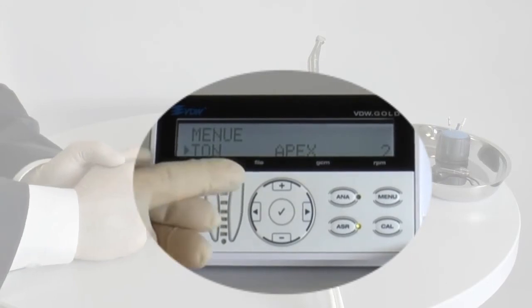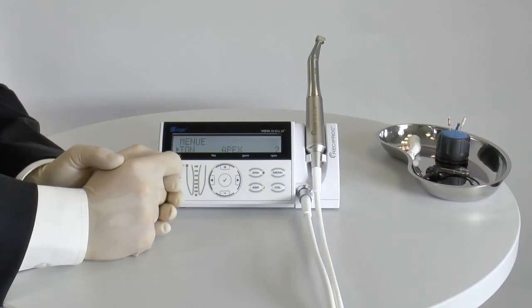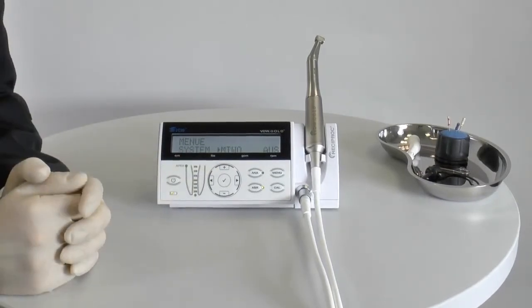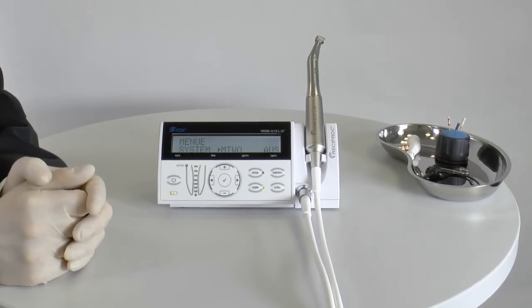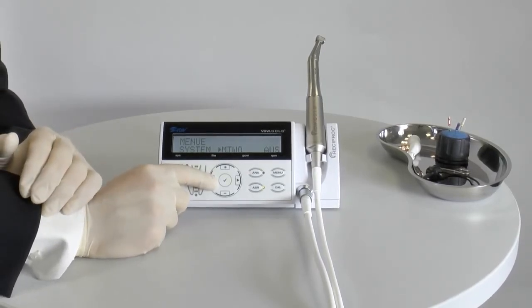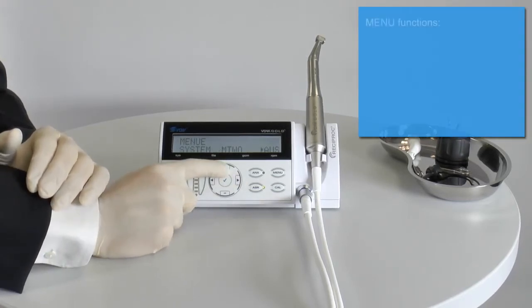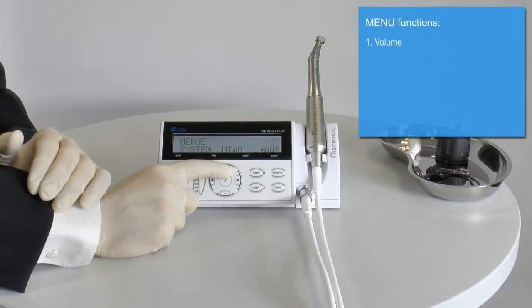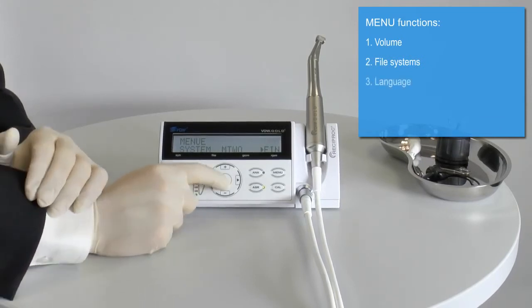You can show and hide file systems according to personal preference. To do this, select system with the help of the plus and minus keys. Use the right arrow key to move to the right and then select the desired file system by using the plus or minus key. Select on or off and then save your changes by pressing the confirm key.